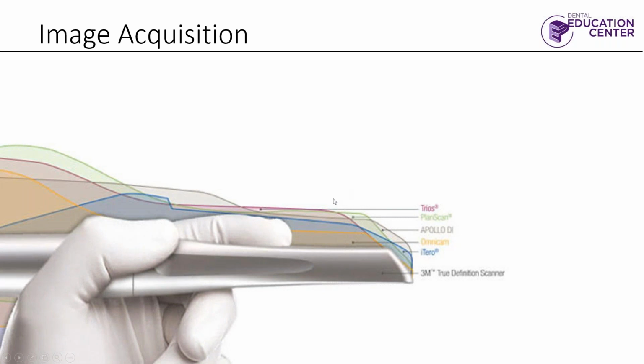This is a graphic. It's relatively still applicable, but the tip sizes. It's really kind of cool when you start overlaying all the different tip sizes on, because it's important when you're actually working with a patient. Sometimes elderly, sometimes children, it's tough to get those back molars. So this is interesting.